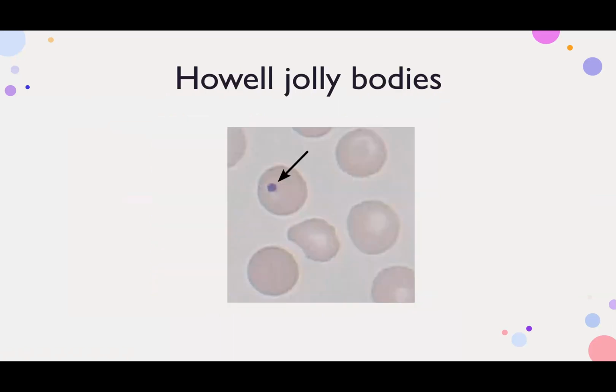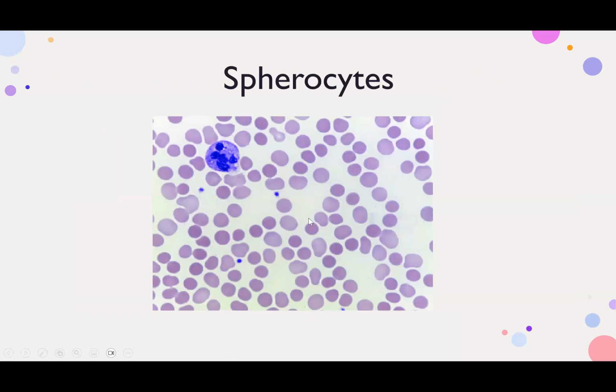Okay? Now how do you know spherocytosis? The RBCs are very round, that's number one. Number two, there is no central pallor. Remember the central pallor I told you about in the beginning? Here there is no central pallor, we call it hyperchromic. That's why in spherocytosis, what do you get? MCHC will be high. MCHC means mean corpuscular hemoglobin concentration will be high.